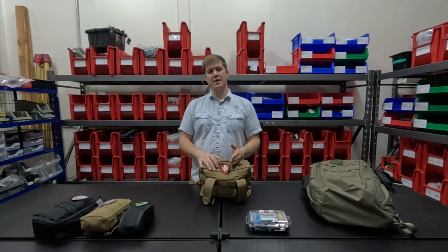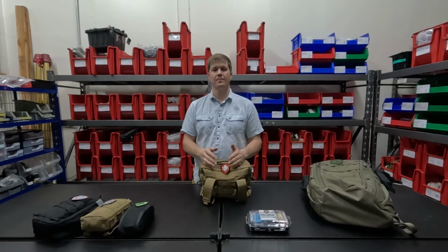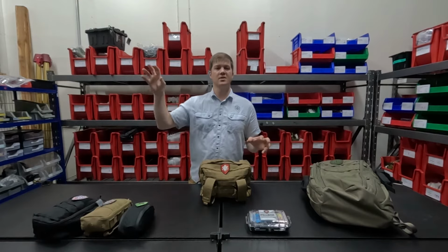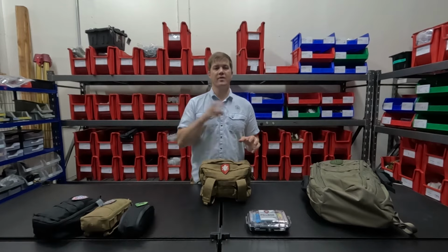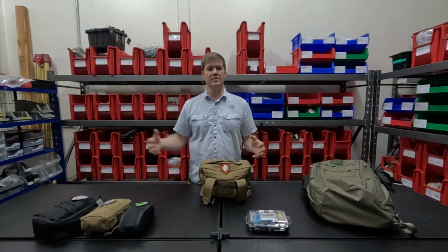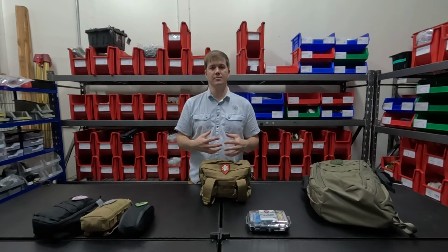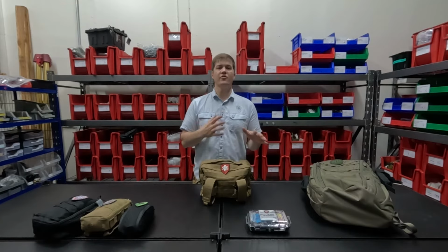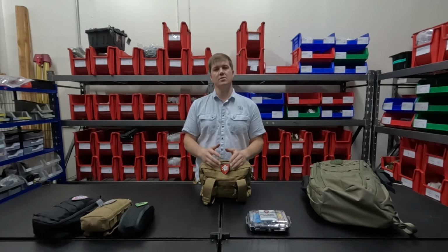When we've got a bigger mass casualty incident, we want to be very focused with how we're taking care of our patients. Because if we dive in too deep with the first patient, the 10th one that's tucked away in a room down the hallway that needs a tourniquet is still waiting. So we've got to get through all these patients in this mass casualty scene and then get them brought together into that casualty collection point as quickly as possible. We don't want to delay care getting too focused too early on advanced options, and this kit is awesome at keeping very focused on what the important parts are.